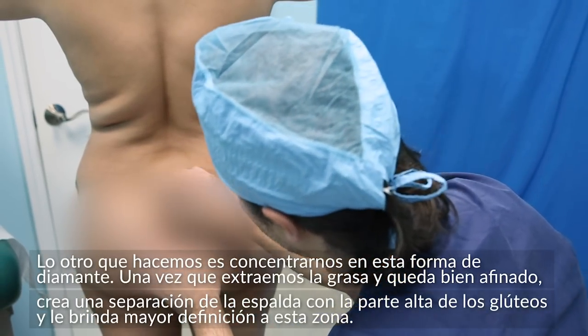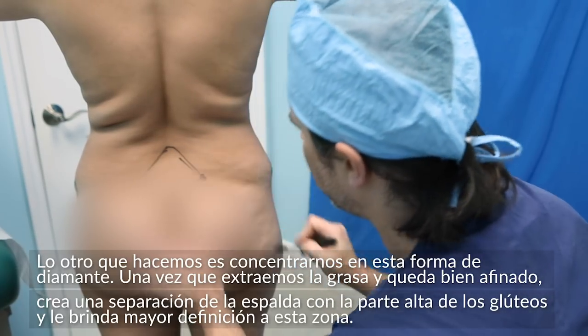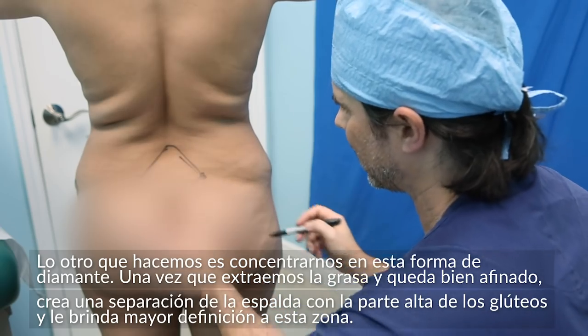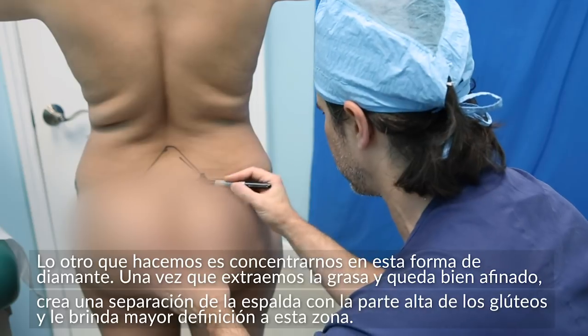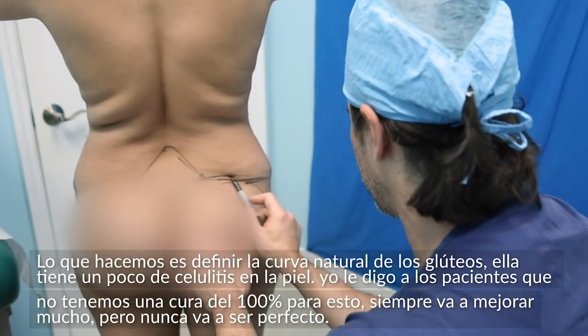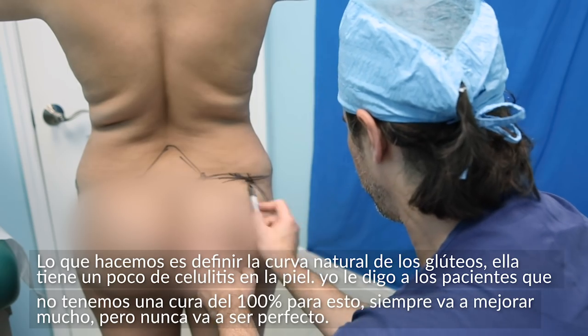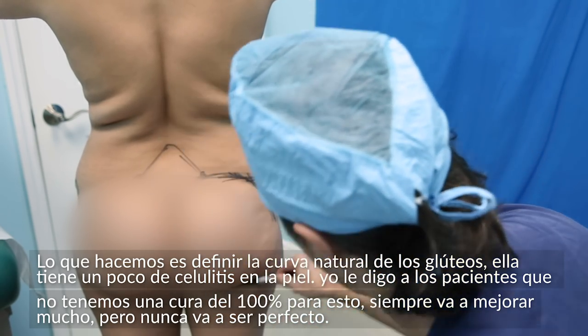This little diamond over here, which we call the sacral diamond right over here — when I carve this out and get this nice and thin, it creates that separation between the top part of the buttocks and gives better definition. I'm defining and I can see where her natural curve of the buttocks is.